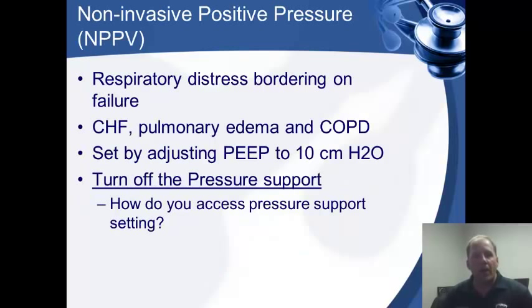All right, let's talk about non-invasive. This is a great strategy. We've been using CPAP for a long time. It's very effective at treating pulmonary edema. CHF patients, they do great with this. You give them some nitro, get them on non-invasive. You can usually get most people out of trouble in a hurry. If you apply these strategies, you can probably get most people out of trouble in 10 to 15 minutes.